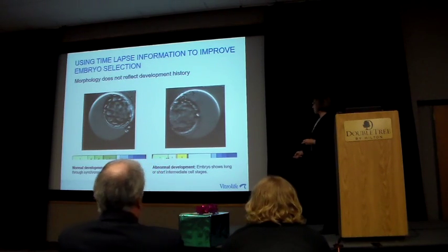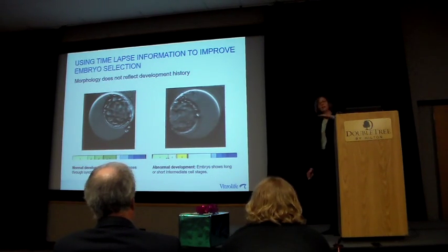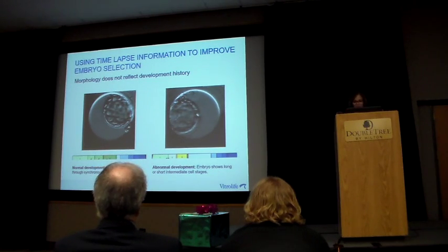And the embryologist knows very easily and quickly that had an abnormal division. I'm going to downgrade that when I come to selecting an embryo. This happens, and it shouldn't. There should be very little yellow showing at all and a lot more green, and that just visually gives you information.